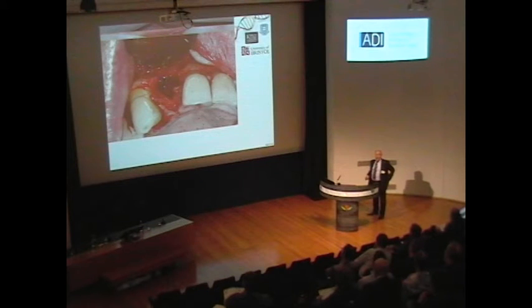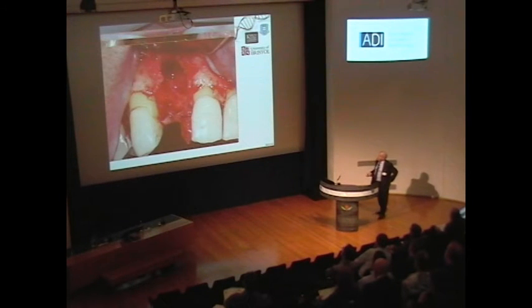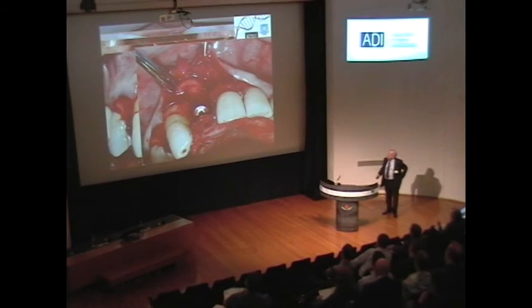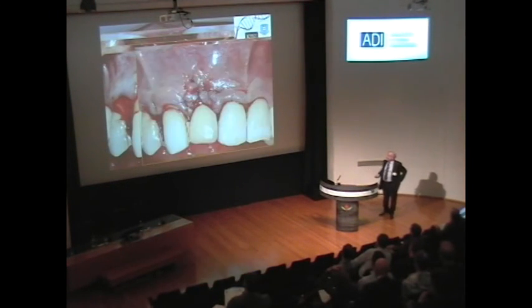And we're going to work underneath that granulation tissue. Okay? And the implant's going to go in. We're going to obturate that site with our bio-oss, you might use bio-oss, and we're going to cover it. Alright? There is nothing. The only retention for this implant is actually in the apex. Cover it up as before.